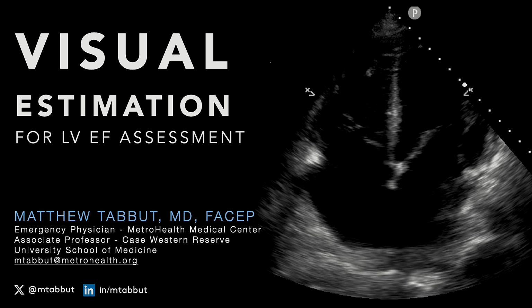So the last couple weeks in our conversations, we've been going through various different methods for determining left ventricular ejection fraction. This all came up over the course of the last several months as I've been looking through some of our QI and really wanting to dial in our ability in the emergency department to hit that left ventricular ejection fraction solidly every time we see it and every time we write up a report, so that when our cardiologists look at our images, they can say, hey, these are quality images. We really trust what the ED is putting out.